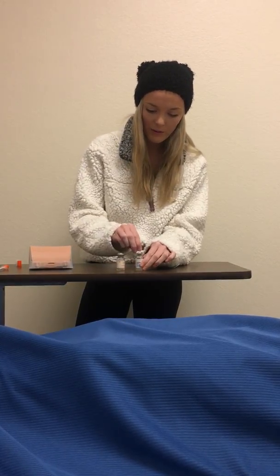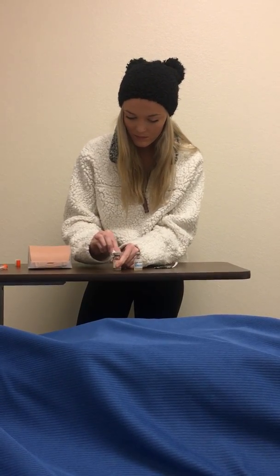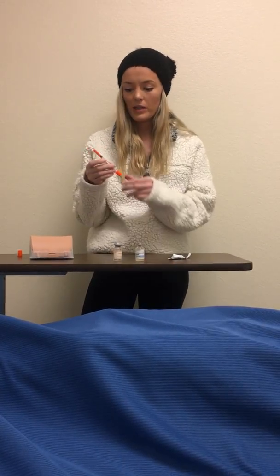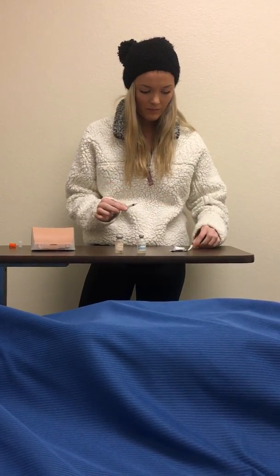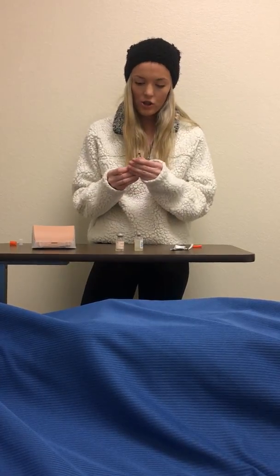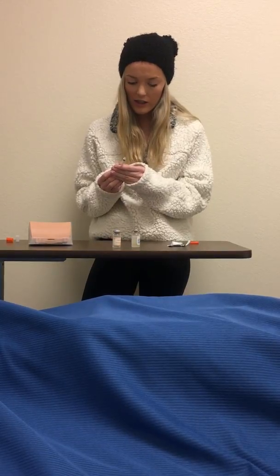I'm going to clean both of the vials. Okay, this is an insulin syringe. You can tell because it's in units, and it also has the orange cap, which most insulin syringes have. First thing I'm going to do is draw up the amount of air that I'm going to be injecting.